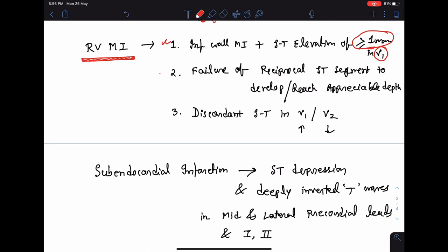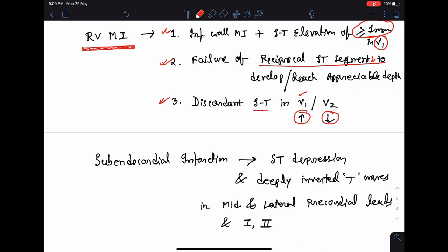Also, failure of reciprocal ST segment depression to develop or reach an appreciable depth is also suggestive of right ventricular myocardial infarction. Additionally, if the ST segment is elevated in lead V1 and depressed in lead V2 — a discordant relationship between ST segments in V1 and V2 — this is also suggestive of right ventricular MI. To confirm right ventricular MI, we take right-sided chest leads V4R, V5R, and V6R to confirm the changes.